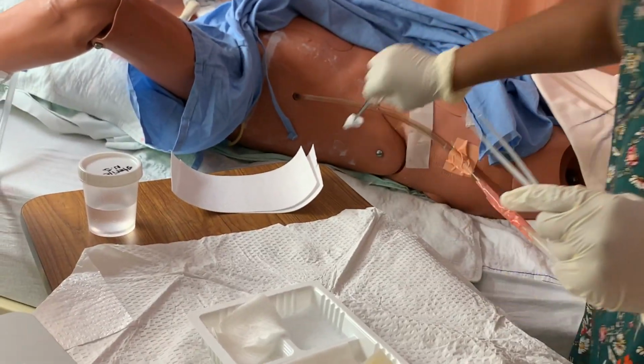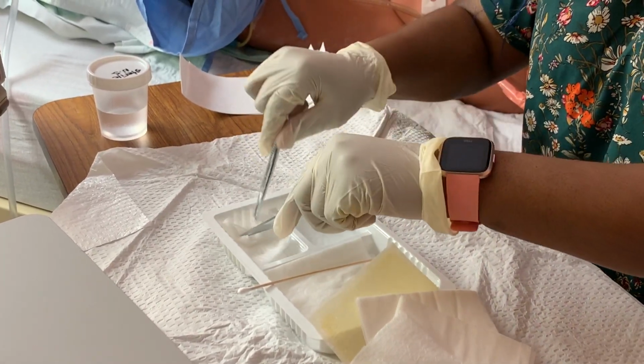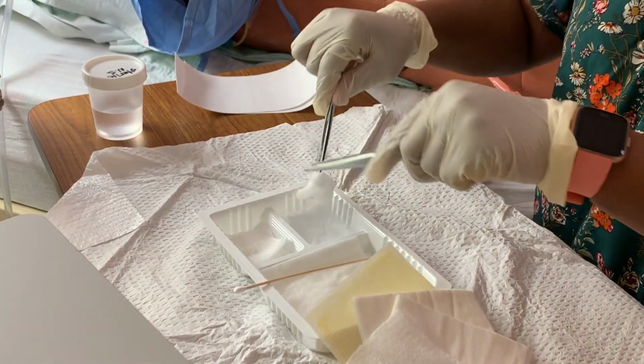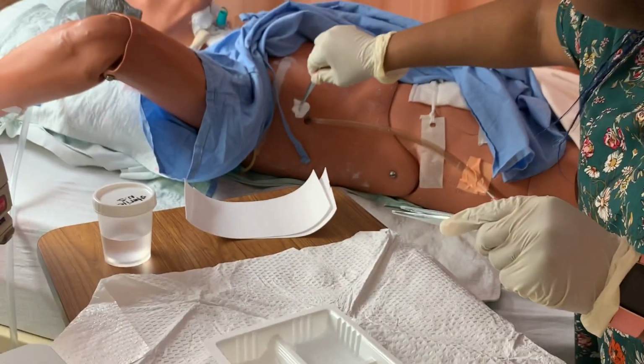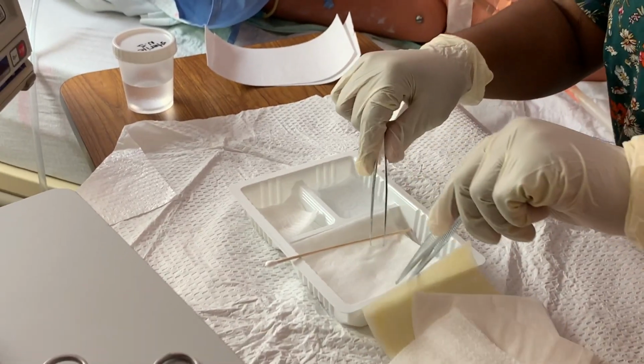And a bigger swipe there. I'm gonna get rid of it. So now I can also clean my tubing. So that's good. Now I'm gonna dry.